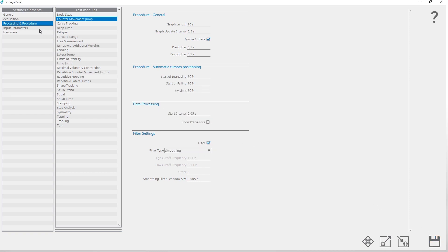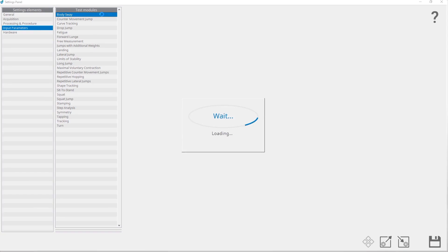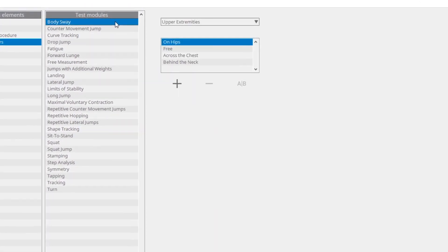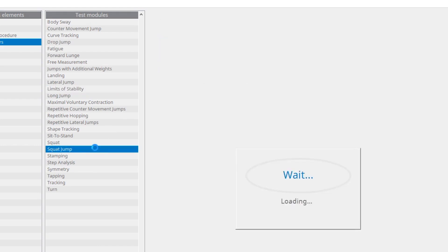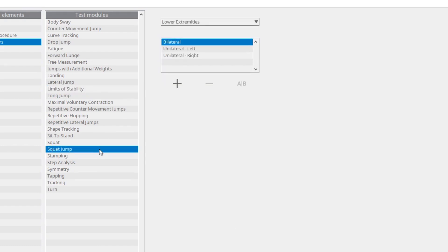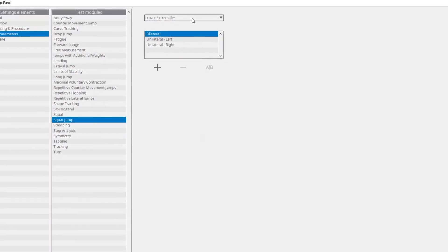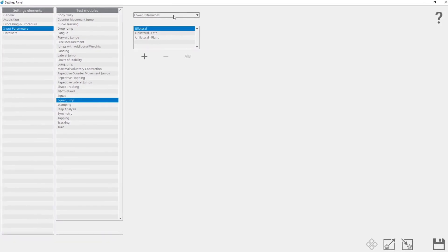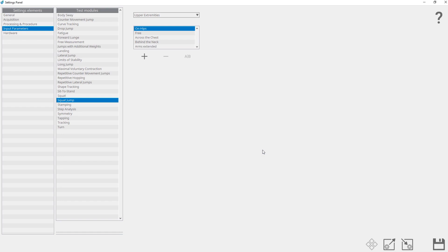Under input parameters, the input parameter values can be added, edited, or deleted for each module separately. Listed here are all the input parameters for the selected test module and all the values for the selected input parameter. An input parameter cannot be added, renamed, or deleted, but values for an input parameter can be added. Default values cannot be edited or deleted. A new input parameter value can be added by clicking on the add input parameter button. For example, you can add a new value for the upper extremities input parameter — write a name for the new input parameter value.